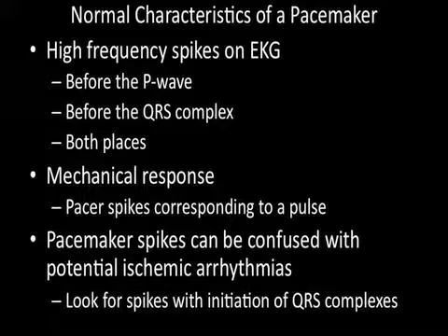A mechanical response is referred to when a pacemaker spike corresponds to a pulse. Pacemaker spikes can be confused with potential ischemic arrhythmias. Look for spikes with initiation of QRS complexes to rule out possible ischemic arrhythmias.